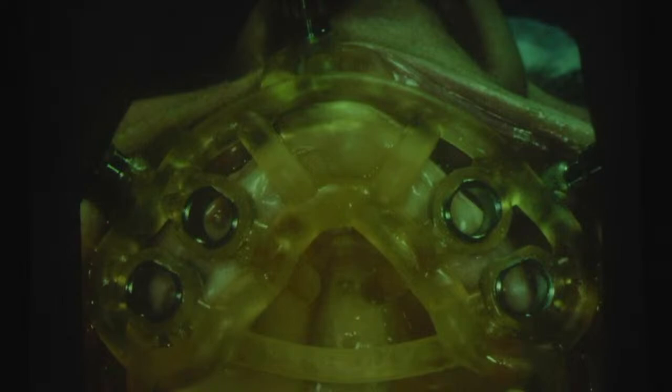Okay, look at this picture very carefully. This is an M guide, and we fixated the M guide on the upper jaw. Is there any need to make a retraction? And you can work like this with only one hand, because you don't have to use the mirror in your left hand.